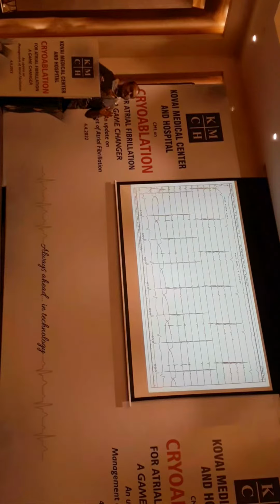When the patient comes back with AF after some time, if you go in and see, you will see that the pulmonary veins are already isolated. This AF, what you see after 4 years or 5 years, may be a trigger coming from somewhere else. The pulmonary vein remains isolated once you have done a good cryoablation of the pulmonary veins. So you can see here, I have put an exit block here.